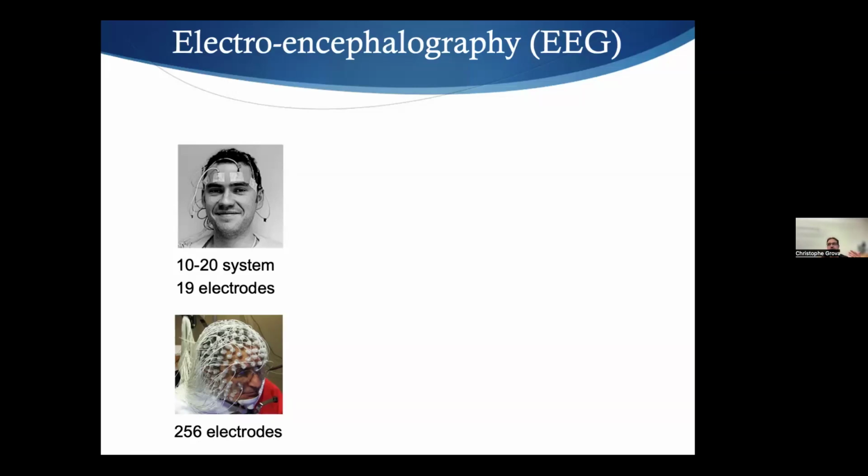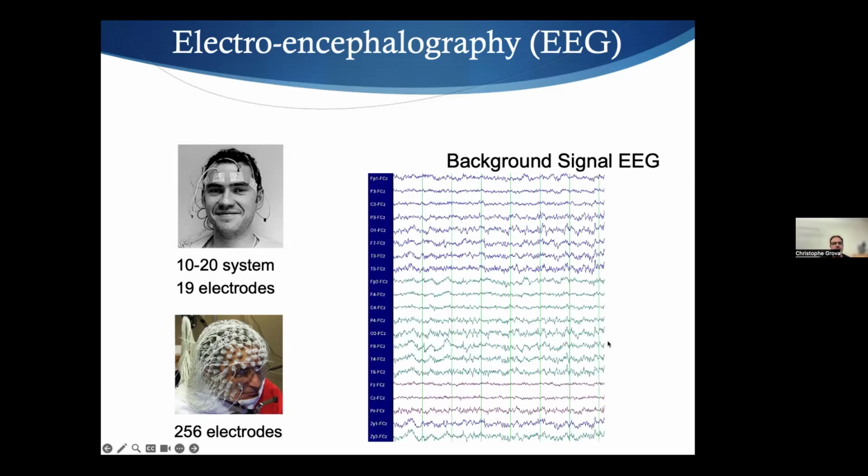And that's also a problem with some of the commercial EEG caps that you see mainly for applications in psychology. Some will stop there and you are really losing some. So now most of the caps are more high density and they will cover nicely all those regions. This is an example, a bit old now, they have better systems now, of high density. This is with 256 electrodes. At Perform, we have a similar system that is actually MRI compatible. And this is an example of a background EEG where you see all your EEG lines. And here you see the time resolution. You have basically 1 second between 2 vertical bars.